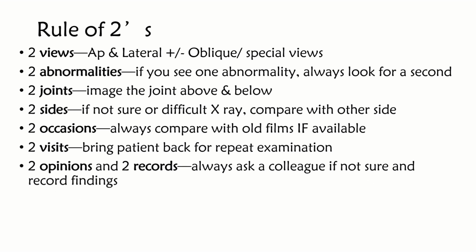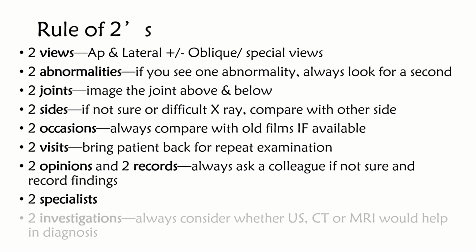Then two opinions and two records. When in doubt, never hesitate to ask a senior if you're not sure about the diagnosis, so that you could record your findings. Then two specialists, one from the field of orthopedics and one from the field of radiodiagnosis. So the opinion of both can be sought in a diagnostic dilemma.